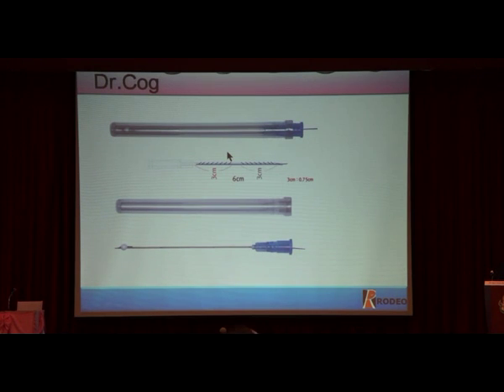The thread is bidirectional barbed thread first. Needle sizes are 6 and 9. For needle size 6, the barbed thread portion is 3 and 3, and the normal PDO portion is 3. Total thread size is 9, lengthening is 9 because the barbed area is 3 and 3.